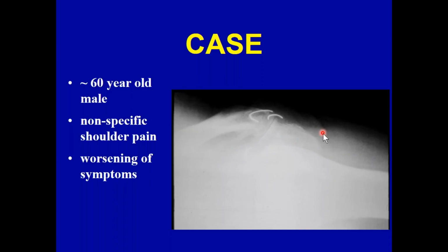Does he need some kind of surgical intervention? So it starts with your good shoulder radiograph. That's where the discussion is starting this morning, and then things go on to a natural sort of conclusion. Does he need to be referred? Does he need to go to the orthopedist for a surgical consultation about the shoulder? The orthopedist has to worry about the wires that are fractured, and he has to certainly worry about rotator cuff interventions possibly. But it all starts with a highly diagnostic film of the shoulder.